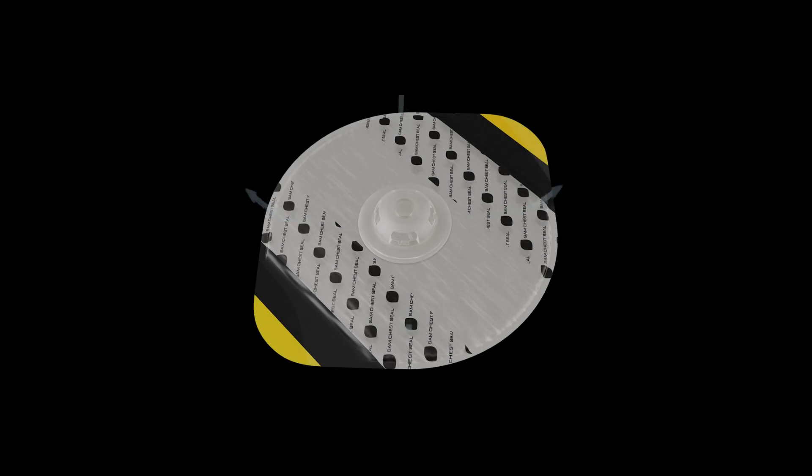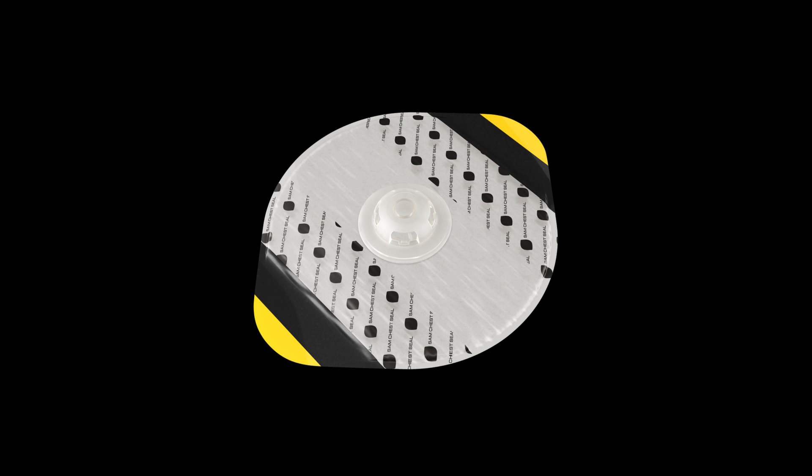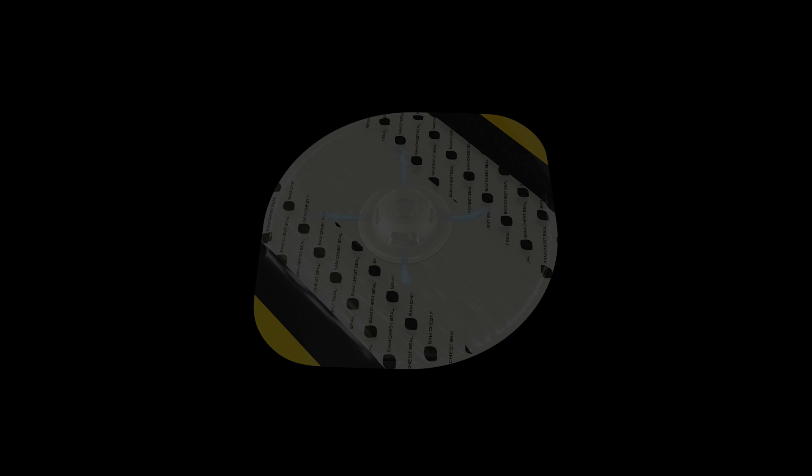The TruFlow valve's rigid raised dome valve ensures one-way airflow from the chest cavity no matter the pressure applied. Large side vents minimize internal obstruction from blood, clots, or soft tissue. Whether in transport or in the presence of heavy body armor, the TruFlow valve will continue to vent.